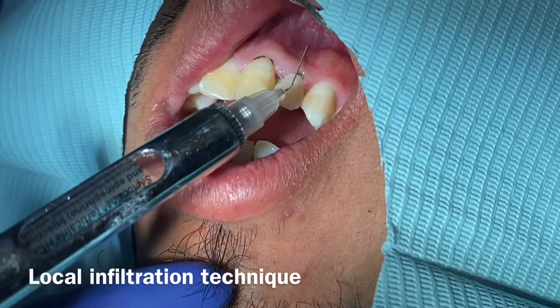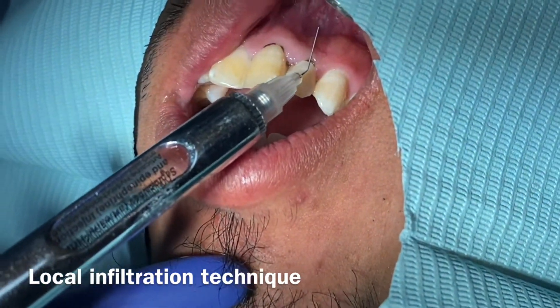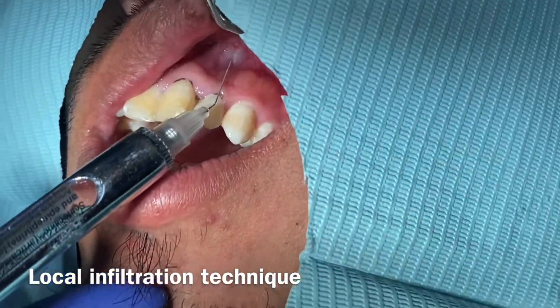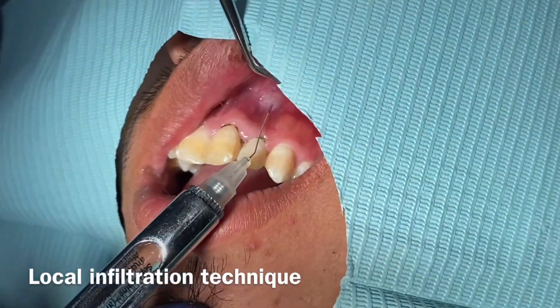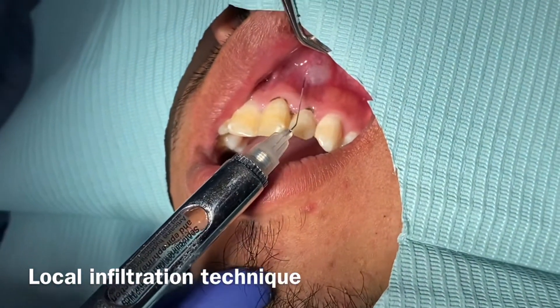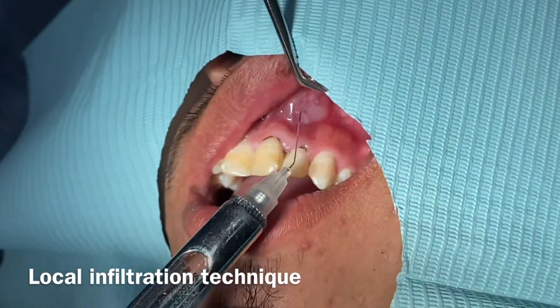Good evening everyone, welcome back to my YouTube channel. I'm excited to walk you through the steps a dentist would do for a deep cleaning. The first thing is you put the topical anesthetic on — I skipped showing that step — after which the topical is applied to the numbing area and the dentist would numb you. There are two ways to numb. This video is also important for hygienists or dental assistants who are beginning to learn about dentistry.